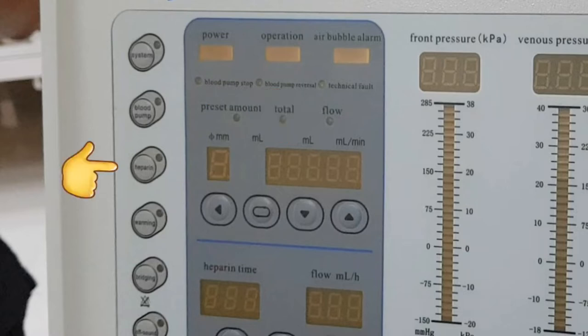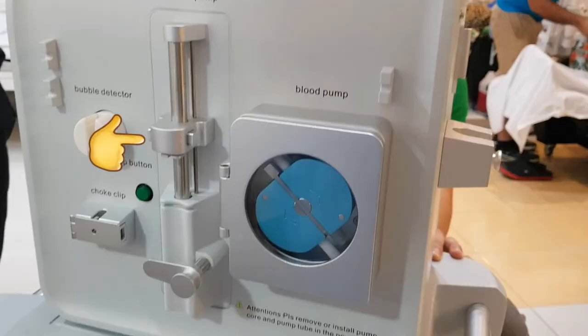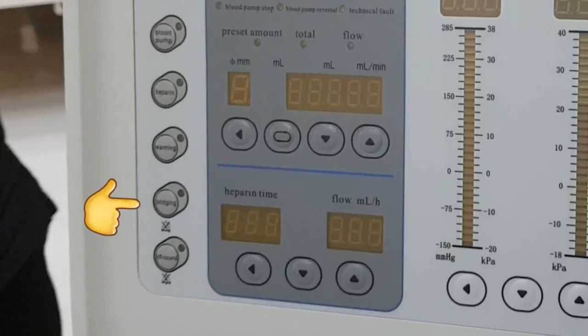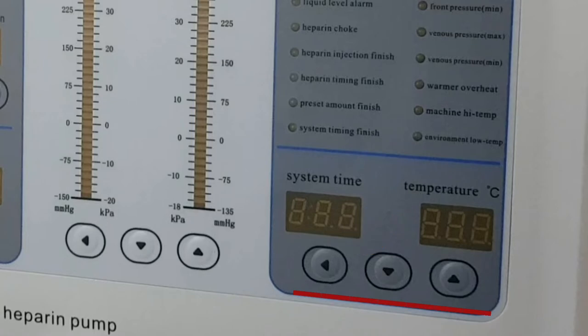Heparin: we have not tried the machine in an actual procedure, so I'm not sure exactly how this functions. But from the look of the heparin setup, which is similar to Fresenius, I assume pressing it will give the set heparin dose and then the set interval rate will start. This is the part where you set the heparin time and flow rate. Warming: similar to conductivity temperature in a dialysis machine, but since there is no dialysate, this machine has its own blood warmer to complement body temperature.